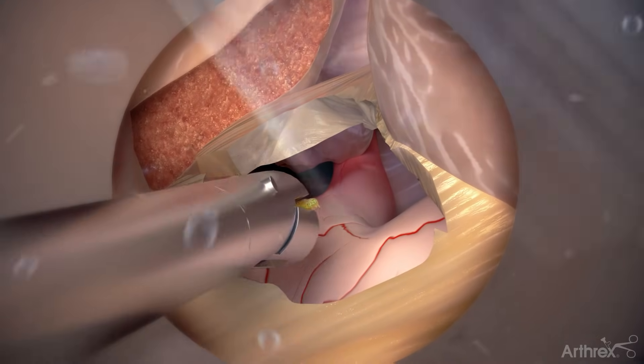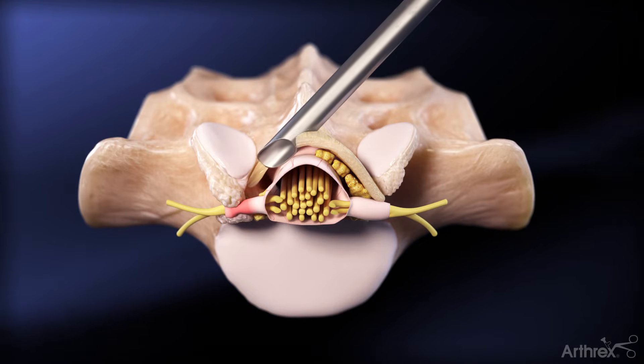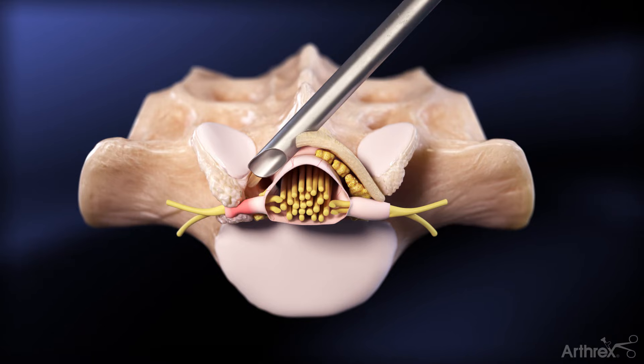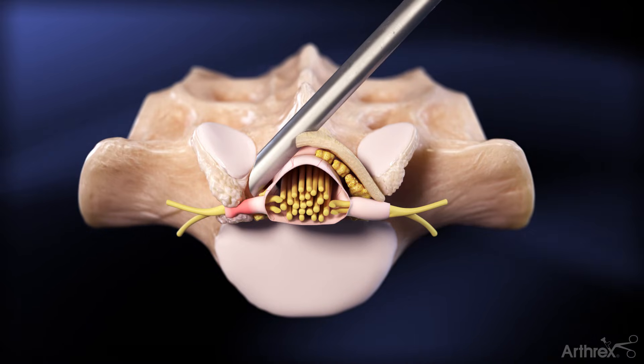After removing the epidural fat, advance the cannula towards the contralateral recess. Once the contralateral recess is visualized, advance and rotate the cannula to retract and protect the traversing nerve root and the dura.